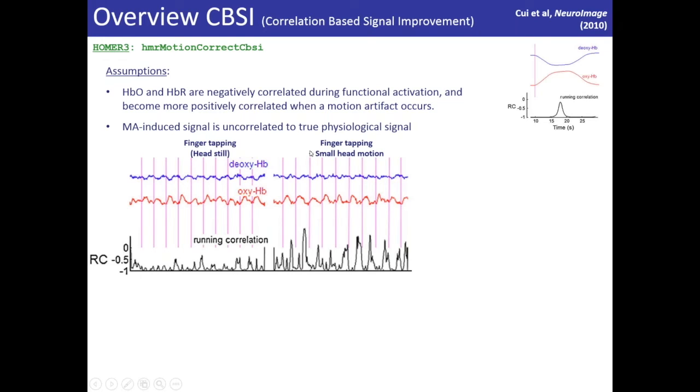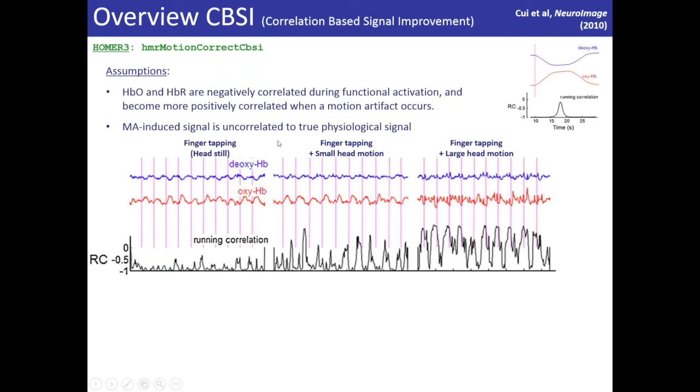What they did here is, by the way, sorry, I didn't mention that, these pink vertical bars represent the stimulus onset for a finger tapping test. In this first one, they were keeping their head still. But in the second one, they also add a small head motion. And now, as you can see, the running correlation is going towards the positive. This is 0, and now we have these positive values. They also did an experiment where they had large head motions as well as finger tapping. Here the correlation is almost always positive. This is the 0 line, and during the task, it goes up always in the positive range.